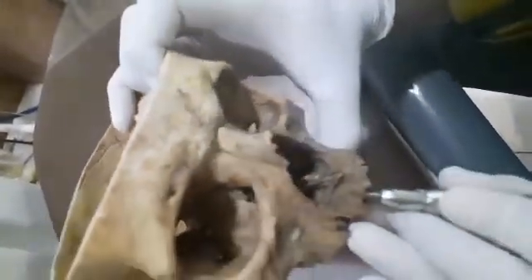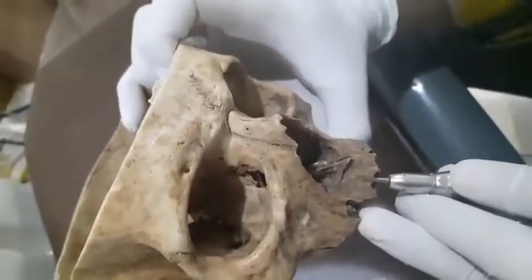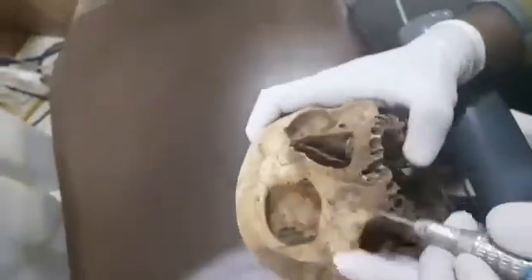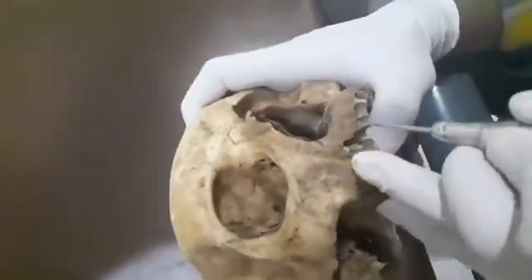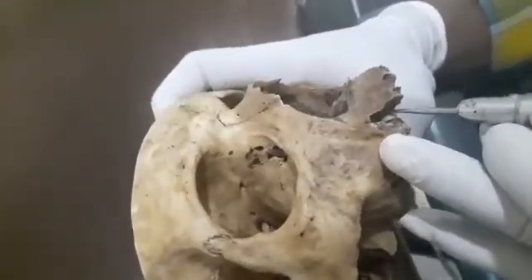This is the region. We have reached here — you just have to perforate. This has happened for the central region. Now for the canine region, see this.